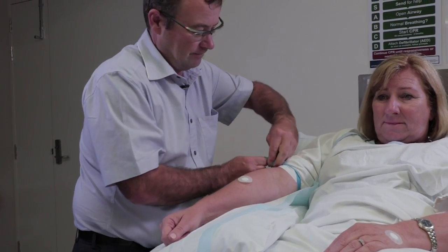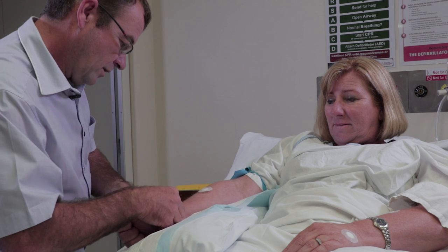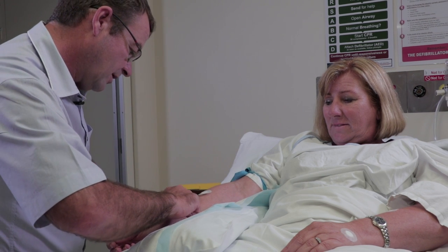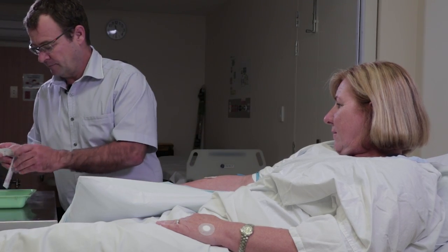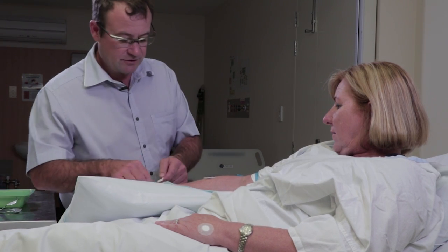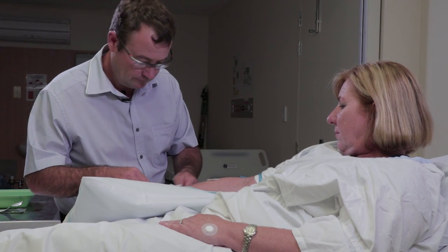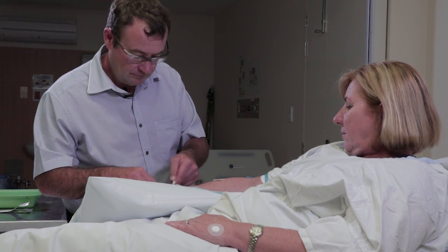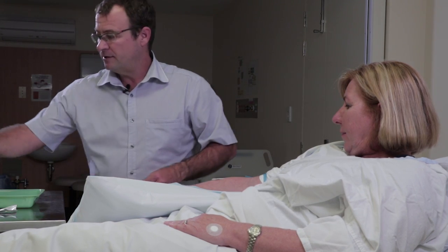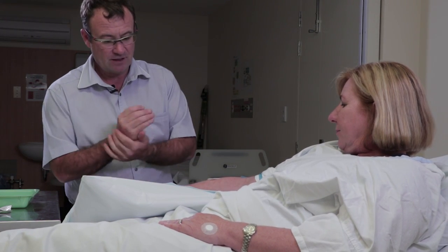Alright, I'm just going to pop a tourniquet around your arm — we'll just see what your veins are like there. We'll go down here on your arm so then you can move your arm around, alright? Okay, there's a nice one there. This is just some prep solution. Okay, I'll just let that dry — doesn't take too long.